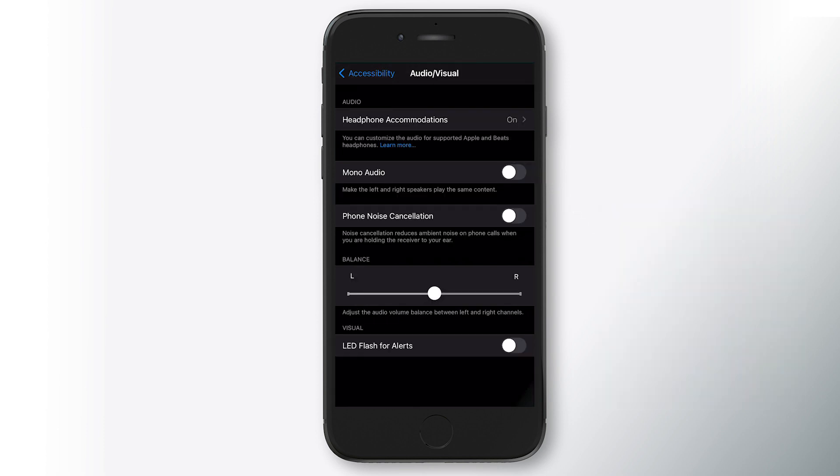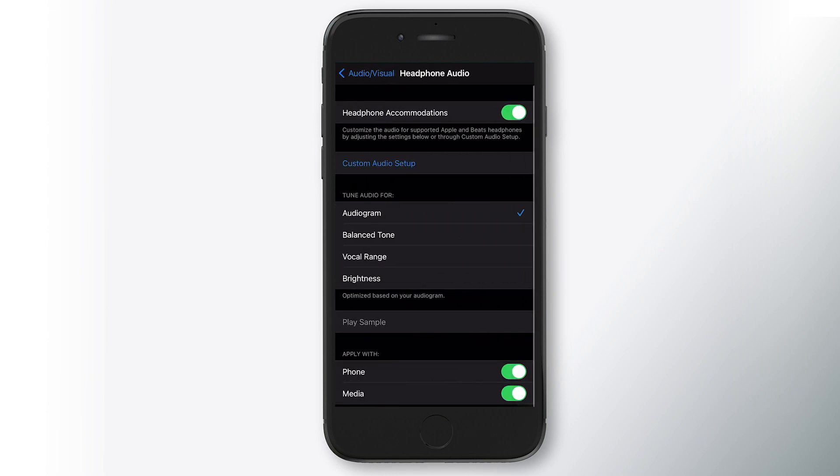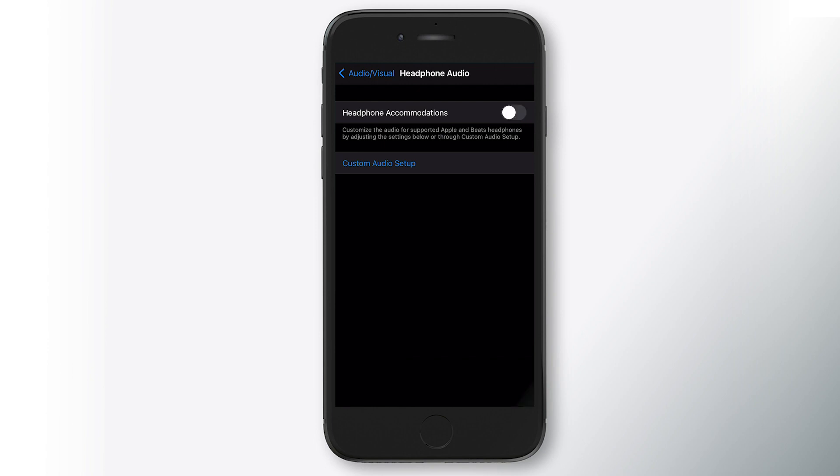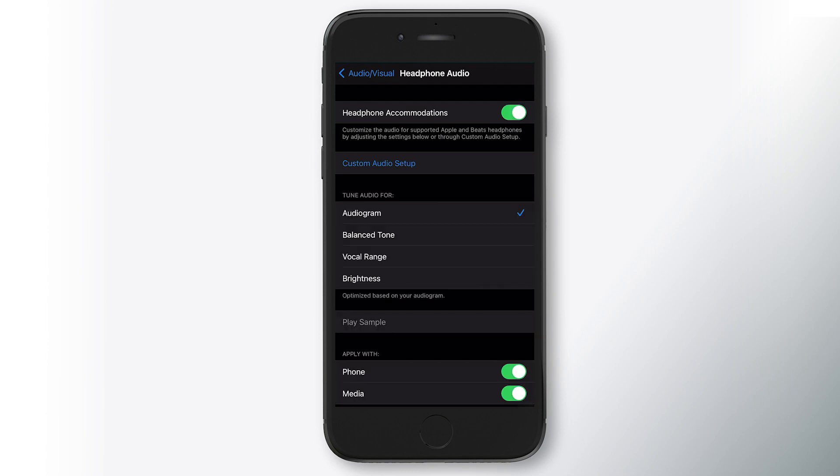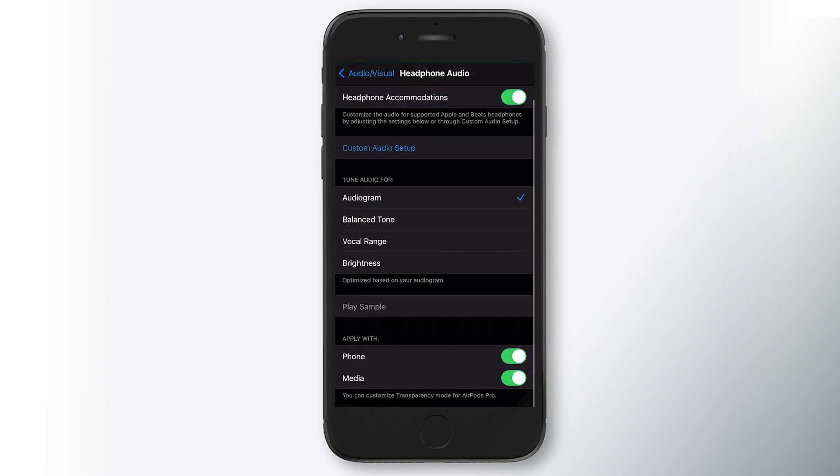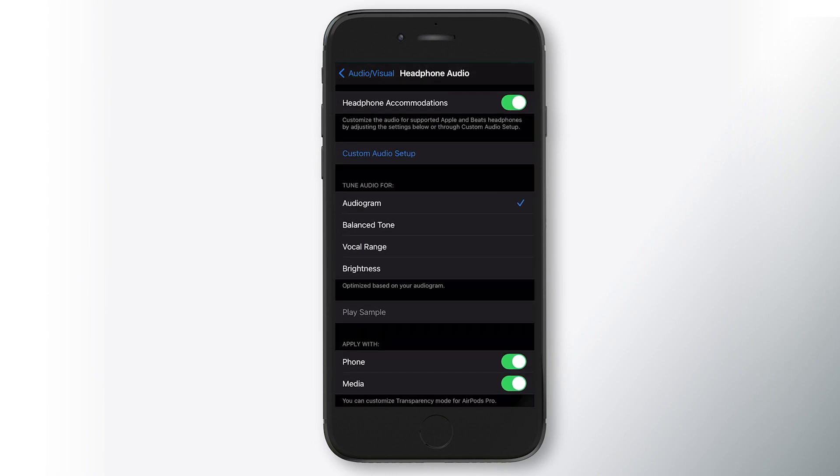Now, at the very top there, you'll see headphone accommodations is on. That may be off for you. If you've just configured, you may need to go in here, turn on the headphone accommodations. The first step once you get in here is you want to go to custom audio setup. You'll see mine is already selected with audiogram. So you want to go through the custom audio setup. First step is you'll want to put your AirPods in.